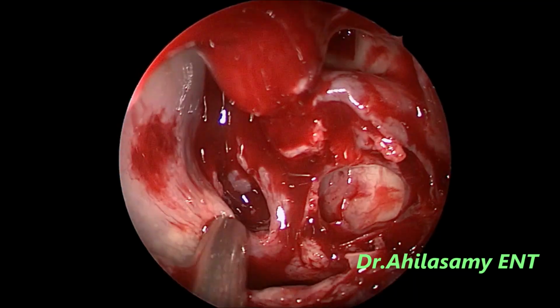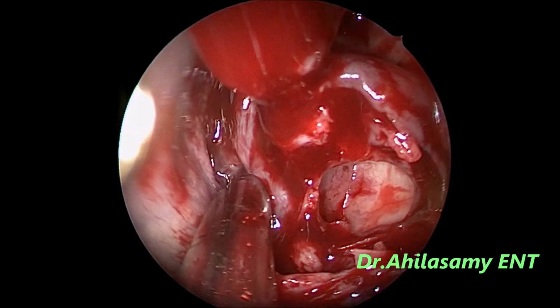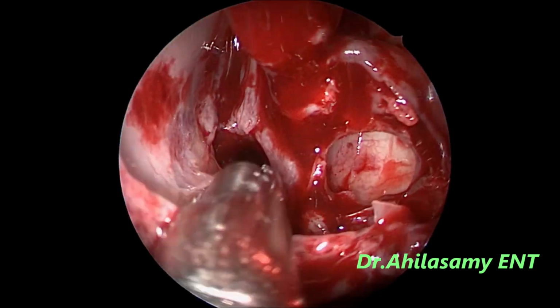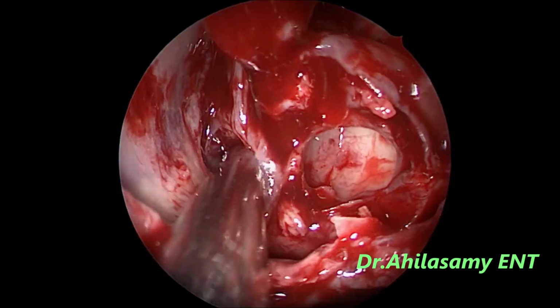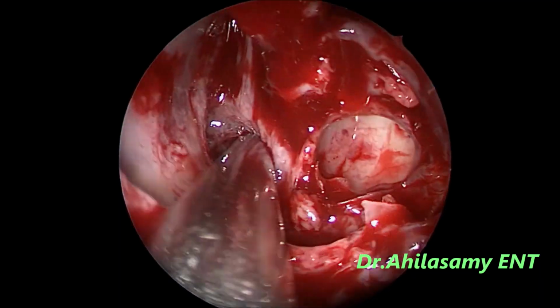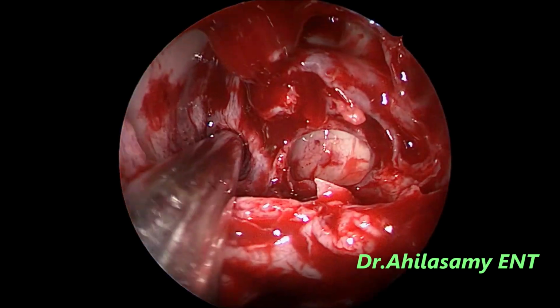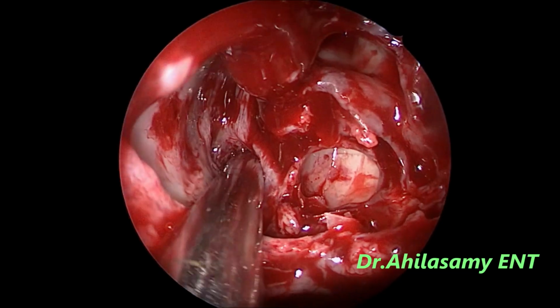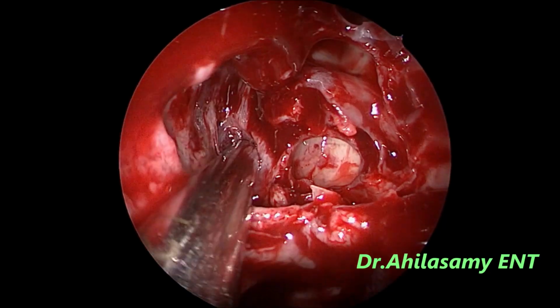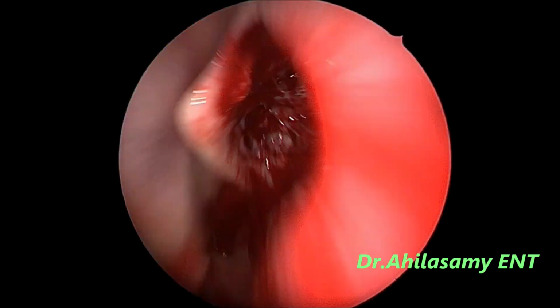I am widening it using the shaver. If there is fungus or more polyps, I will use the Kerrison to take down the inferior, inframedial and lateral parts. In this case, there is not much pathology inside the sphenoid sinus, even though the CT scan showed some pathology. It all regressed with 1 week of prednisolone treatment.